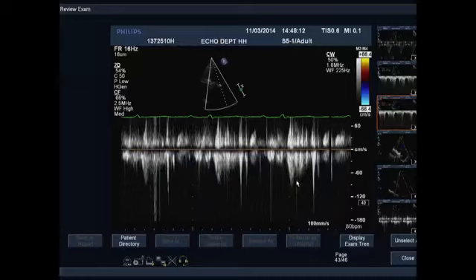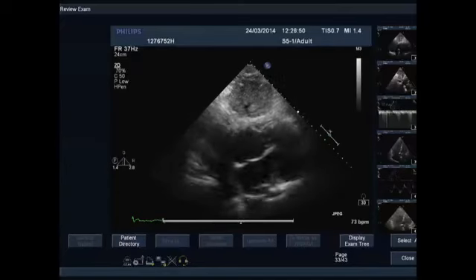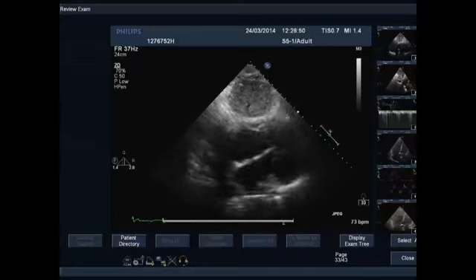Furthermore, it is important to say that in patients with pulmonary hypertension, the literature has shown that the pulmonary systolic notch that you might see on this waveform is associated with increased pulmonary vascular resistance. By positioning the transducer at the subcostal space, we will be able to get the subcostal view. And this is very important because it demonstrates all the 4 chambers, and we will be able to assess the interatrial septum and to see whether the patient has any evidence of atrial septal defect or a patent foramen ovale.